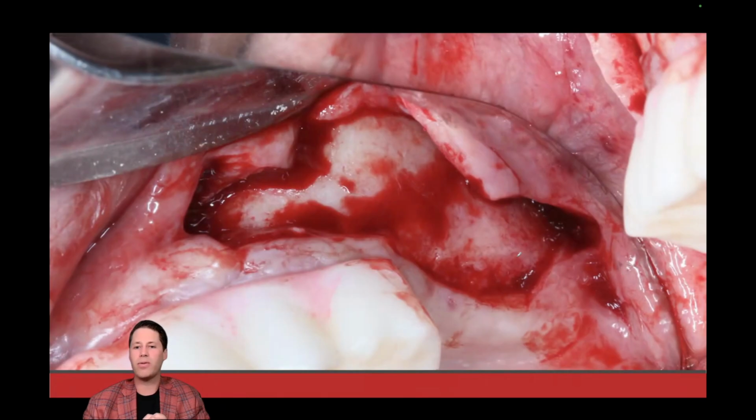So this is a really nice full thickness flap, clean flap reflection, making my incision down to bone using my Oraband knife to score the periosteum prior to reflecting that tissue with the number 9 periosteal elevator. You can see here, good flap access, and my proposed window really should start in this area. It should be about 2 millimeters from the crest of bone, making a large oval access in this area.